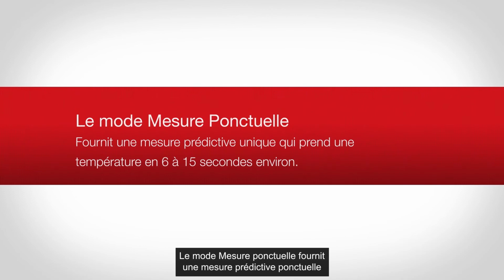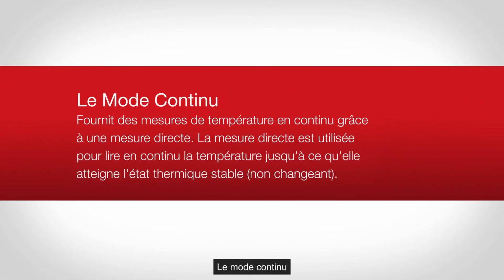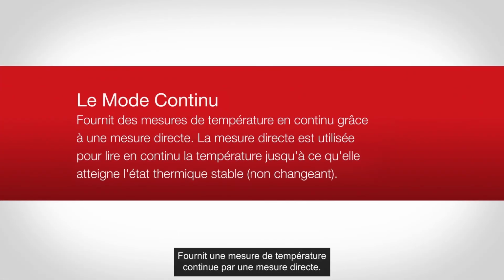Spot check mode provides a one-time predictive measurement that takes a temperature in approximately 6 to 15 seconds. Continuous mode provides continual temperature readings through a direct measurement. Direct measurement is used to continuously read temperatures until it reaches the thermal steady state, unchanging.